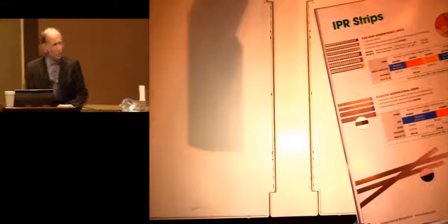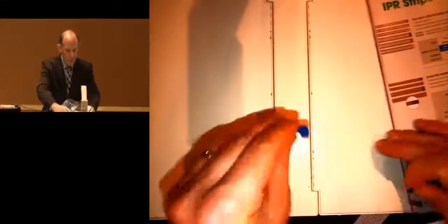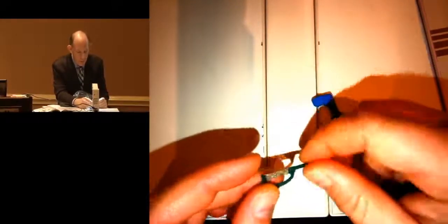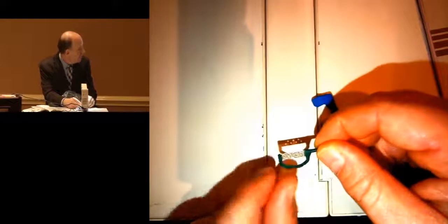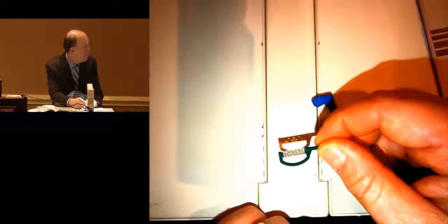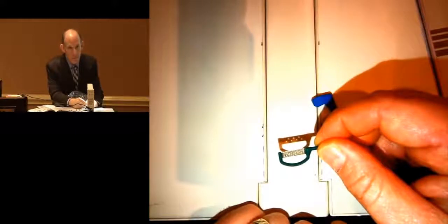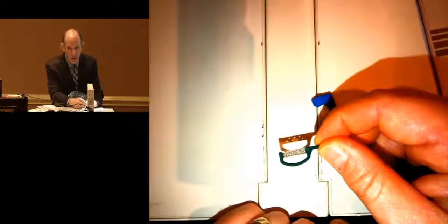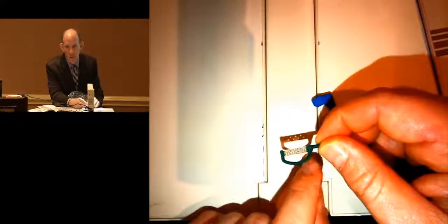Okay, so I'm just going to show you really quickly how this works. Rubber grip here, green file there, right? Everyone sees that? To make this work, do you see the hole there? If you look closely here, does everyone see the shadow? Can you see the perforations? When you look at it, you can't really see them. If you hold it up to the light, you'll see the perfs. But if you look down at the file, you won't really see the perforations. Like I told you, the better quality stuff is all perforated.